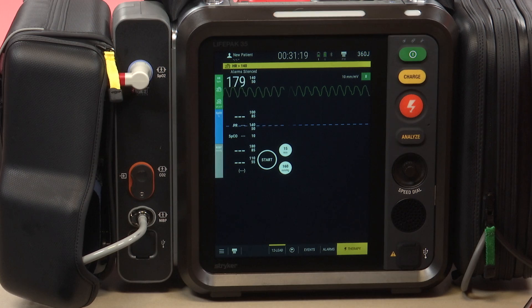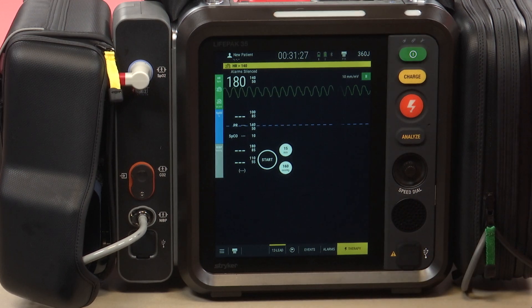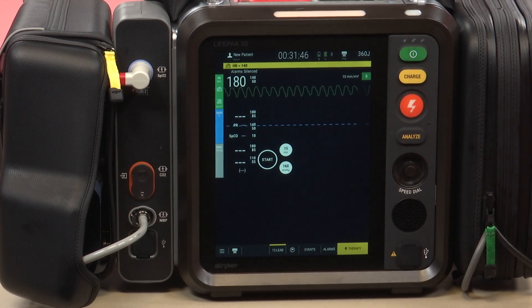For this video, we will show the synchronized cardioversion feature of the LifePak 35 cardiac monitor. In this case, we have a patient that is in VTAC as you see here on the screen. This patient is not hemodynamically stable — their systolic blood pressure is below 90 and their mental status is poor. As a result, we've elected to use electrical therapy via synchronized cardioversion on this patient.